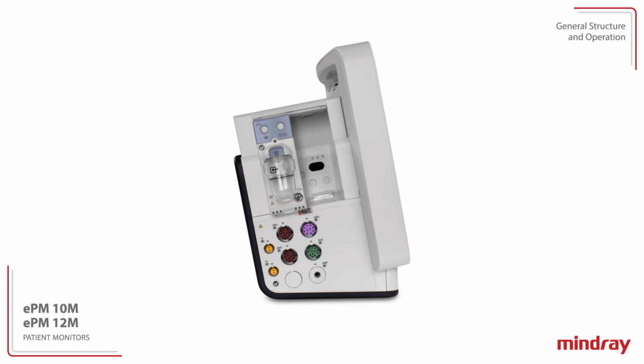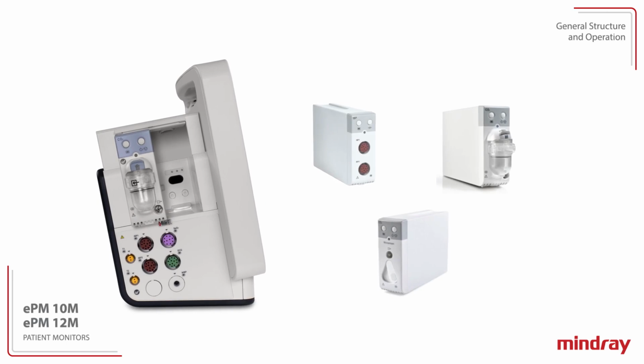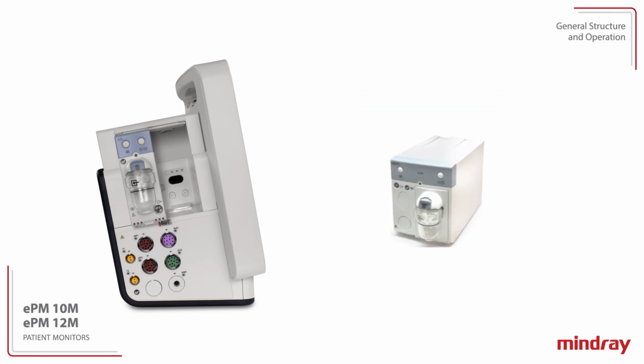The following modules are supported on the ePM 10M and 12M patient monitors: 2-channel invasive blood pressure, side stream CO2, microstream CO2. The ePM 12M patient monitor supports the multi-agent gas module for monitoring anesthetic gas.